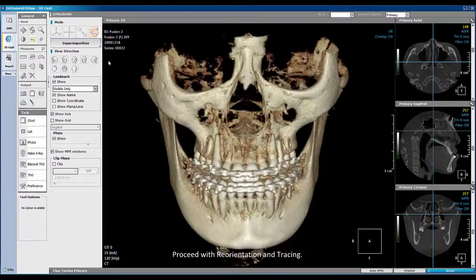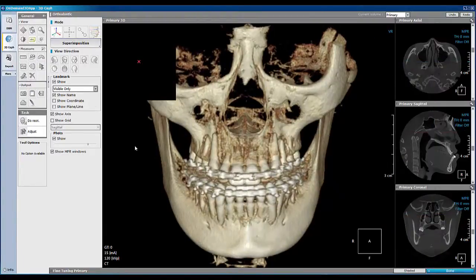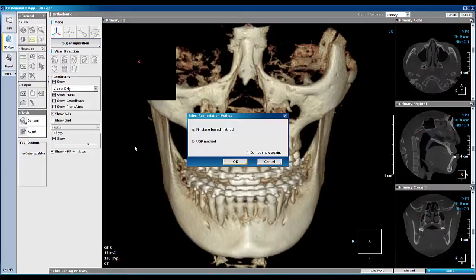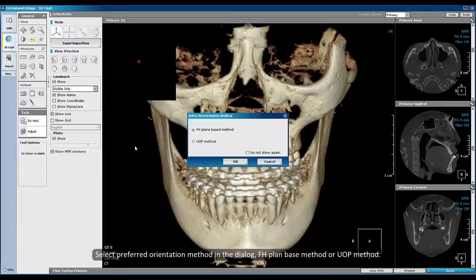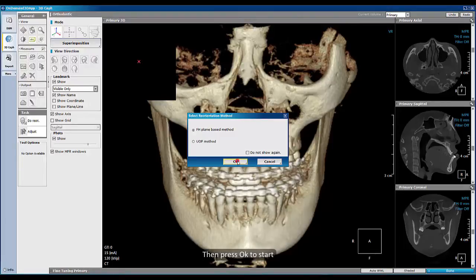Proceed with reorientation and tracing. Select the preferred orientation method in the dialog: Frankfort plane-based method or UOP method. In this case, I will choose the Frankfort plane-based method. Then press OK to start.